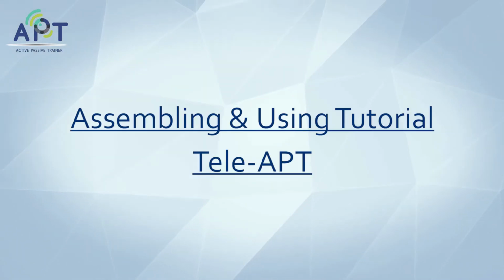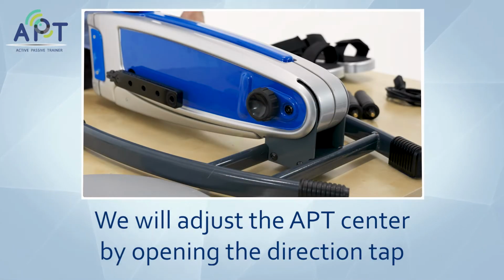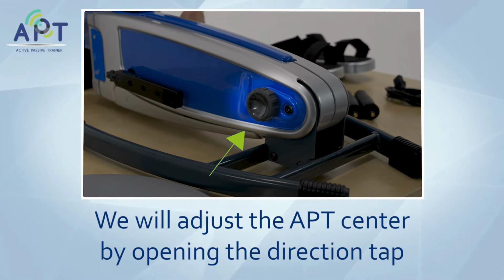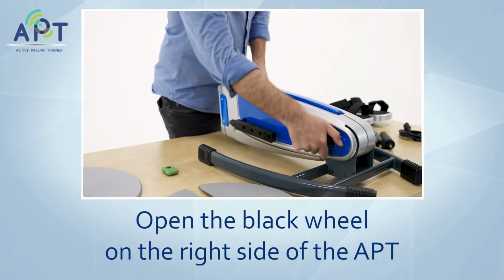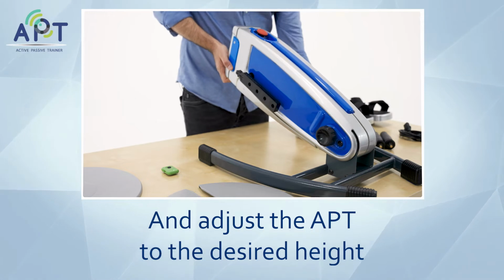Hello everyone, this video will demonstrate how to assemble the Tele A.P.T device step by step. After removing the A.P.T from its box, we will adjust the A.P.T center by opening the direction tap. Open the black wheel on the right side of the A.P.T and adjust the A.P.T to the desired height.